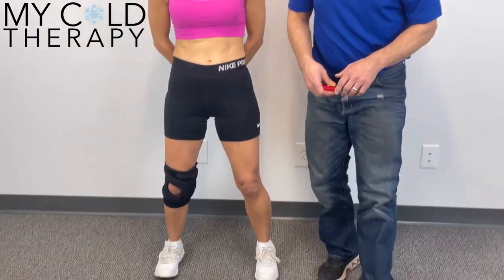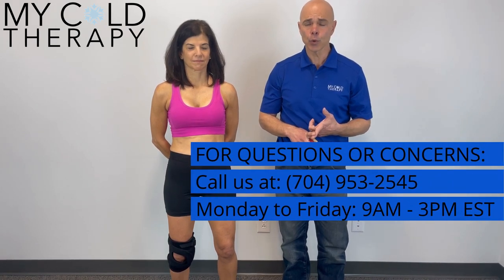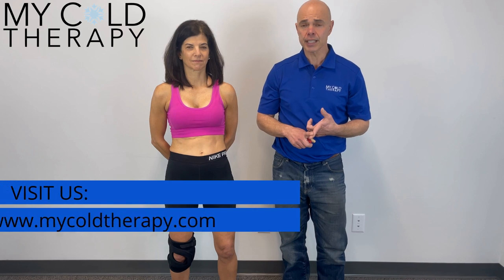This is how you measure for the True Pull Light. Please keep in mind these are both left and right knee braces, so make sure you order the correct one. If you have any questions, give us a call at 704-953-2545 between the hours of 9am and 3pm ET, or visit us at MyColdTherapy.com. Thank you for following along.